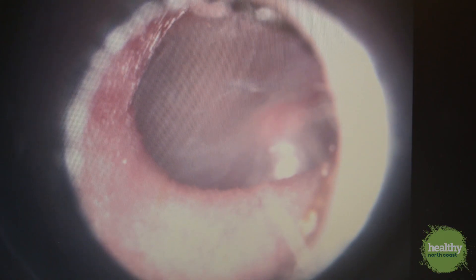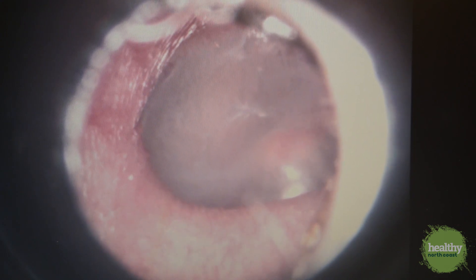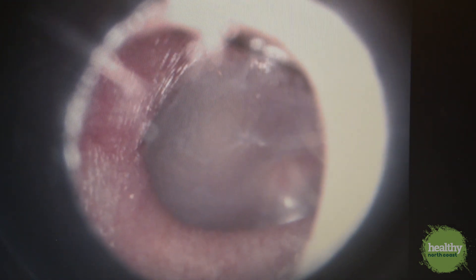If your view on the camera is obscured by cerumen or earwax, you can ask the patient to go home and soften the earwax with regular vegetable oil or mineral oil, or anything they have around the house. They should do this nightly for about a week and then come back to your clinic for irrigation.